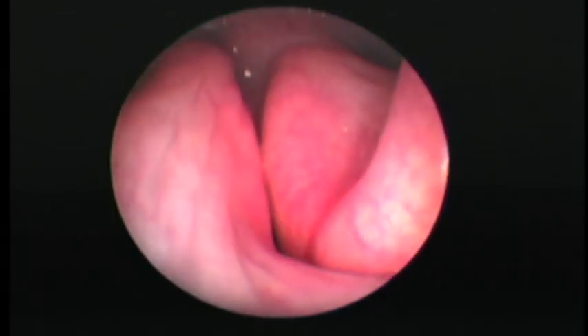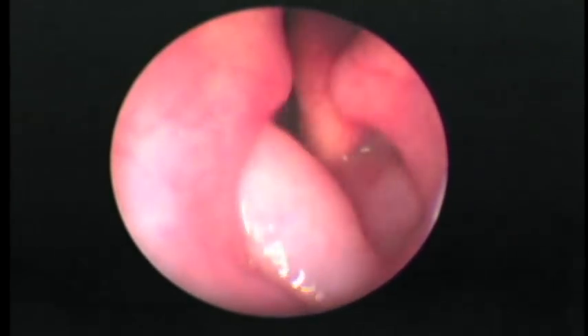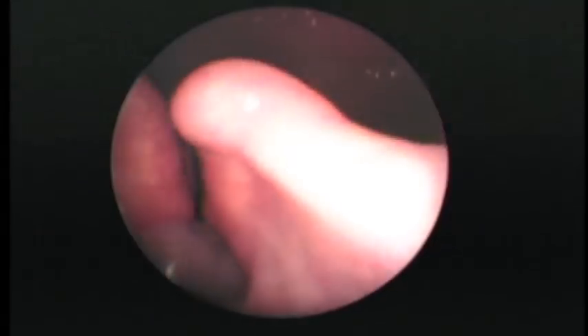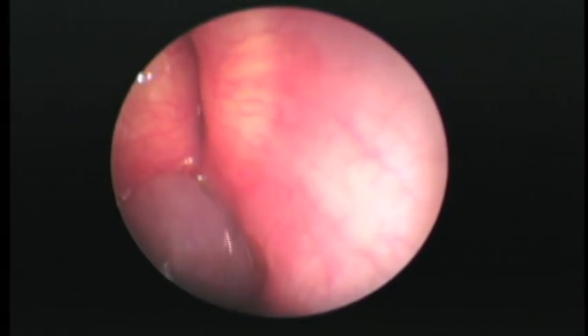But when you get down to the cartilage, now we're at the thyroid cartilage and the cricoid cartilage area. And you open it, and there is one of the very large saccules on the dog's right-hand side. The left-hand side saccule is there also, and you can see that they occlude the vocal folds.